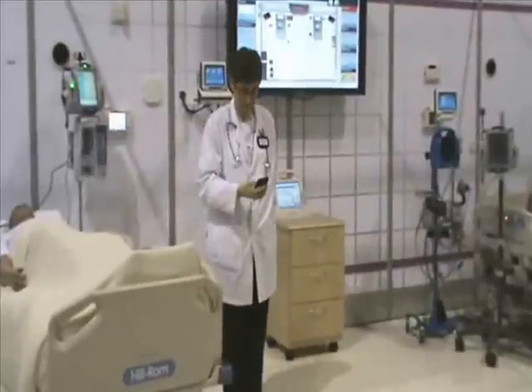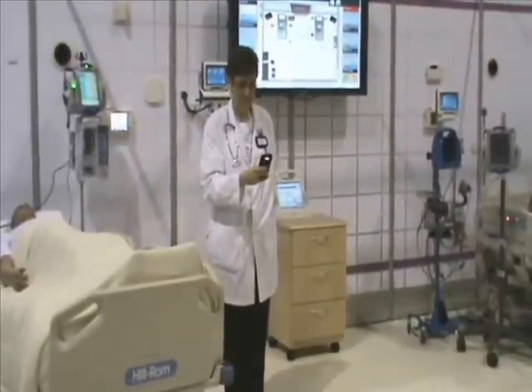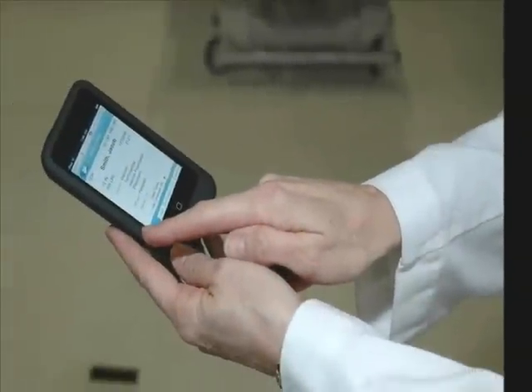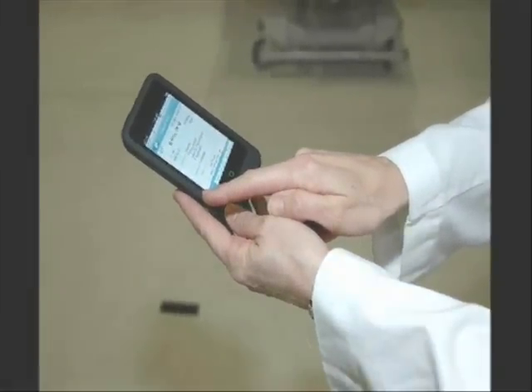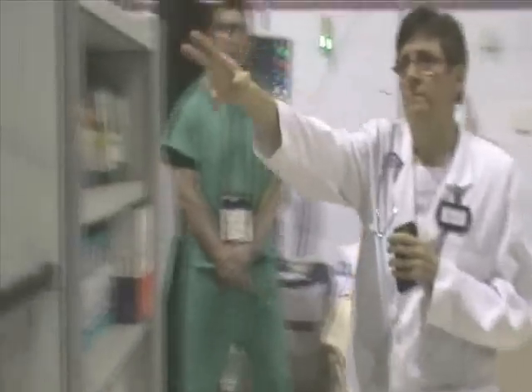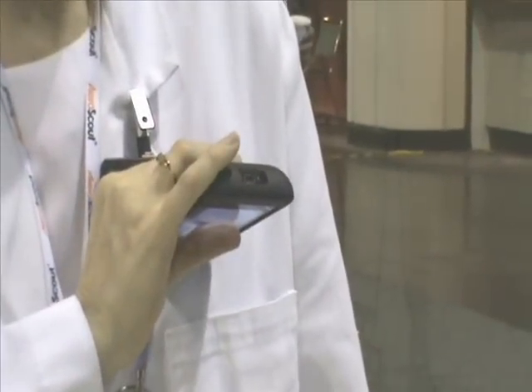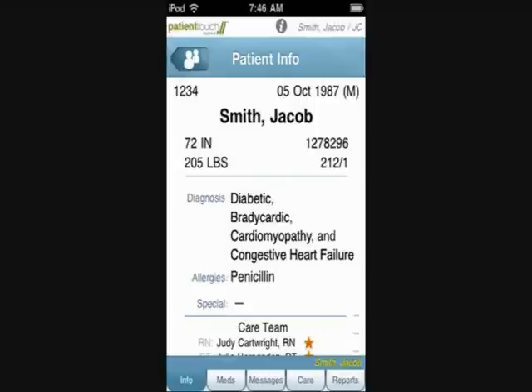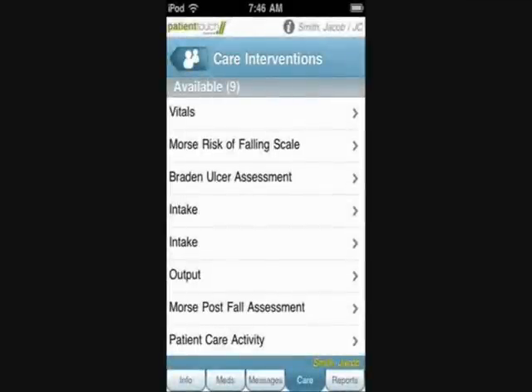We have implemented a medication administration application using a combination of wireless, mobile, and barcoding handheld technologies to provide real-time access to relevant clinical data at the point of care. Since the handheld device is too small for you to see, please look at the monitor on the nursing station. Once I scan my badge to sign into the application, I am presented with my patient assignment for the shift. Jacob has been assigned based on the patient-centric identification previously performed during the device association process. Jacob is a new patient in my assignment, and I can open his chart to view his demographics and diagnosis.